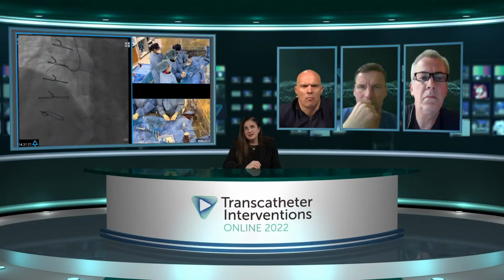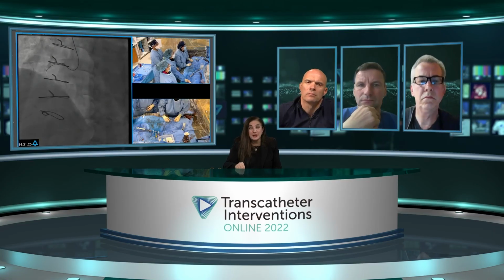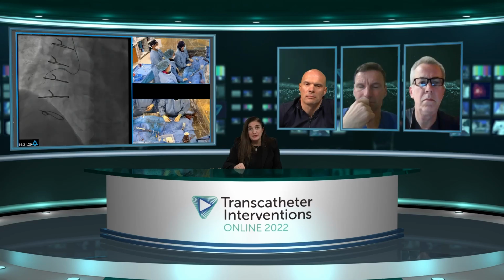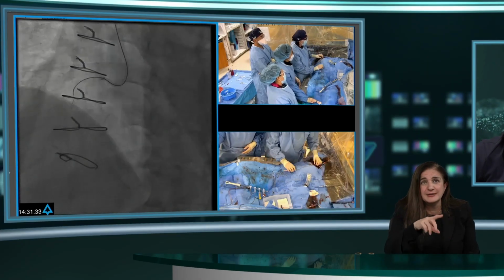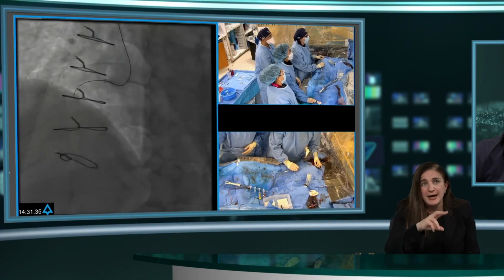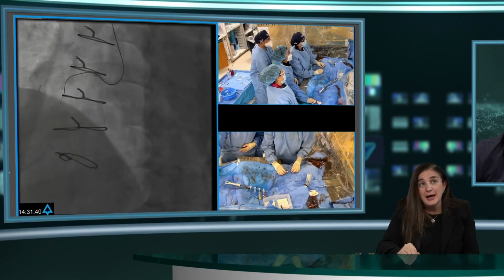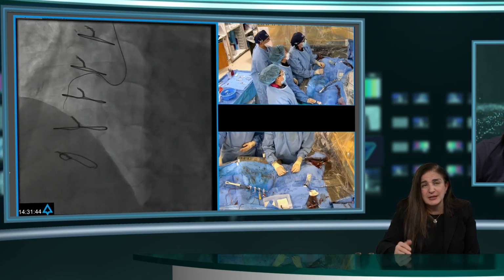Yeah, I think, first of all, 2B means that you can consider it, and that's what you're doing in this particular patient. The truth is that we've all seen a lot of CTOs that are not quite as symptomatic or as approachable as perhaps this one, and in the hands of probably not all of the most skilled operators.